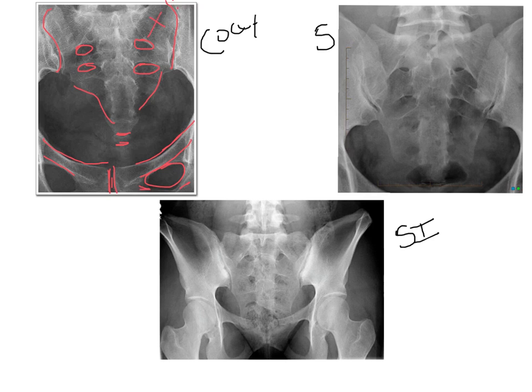Where these X's are up top, you are looking at the wings or the body of the sacrum. We see slight top of the base of the sacrum, and these to the left and right of the SI joints are your ilium. And remember, that is ilium with an I, not an E. An E is for the intestines, two totally separate structures, so make sure that you spell it correctly.